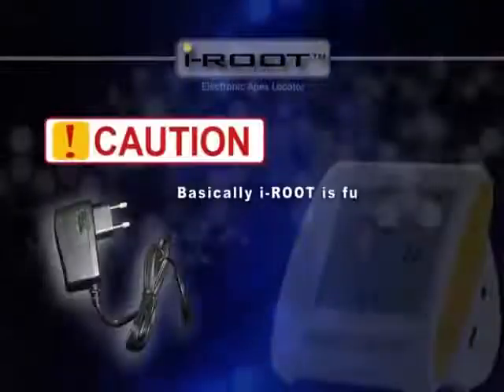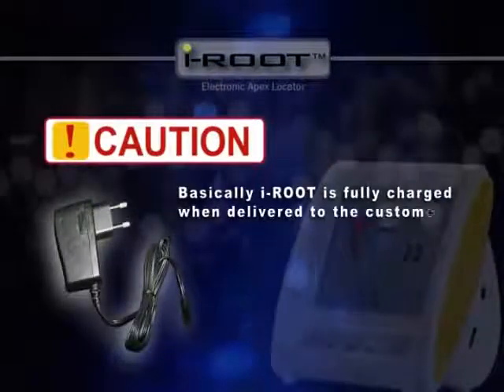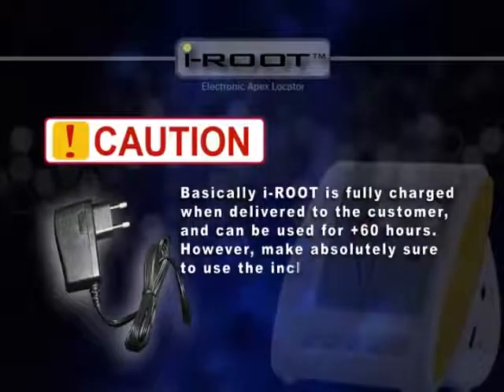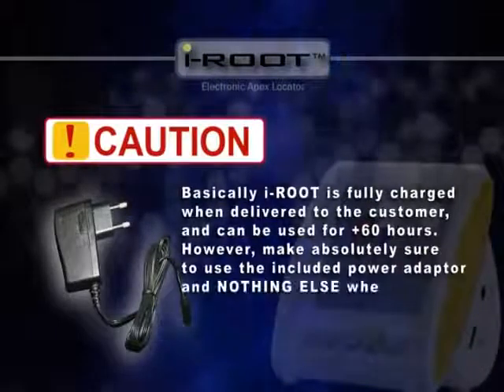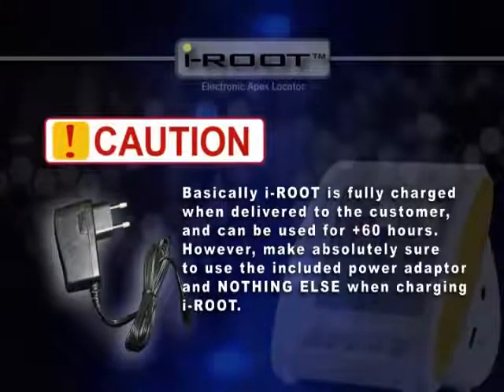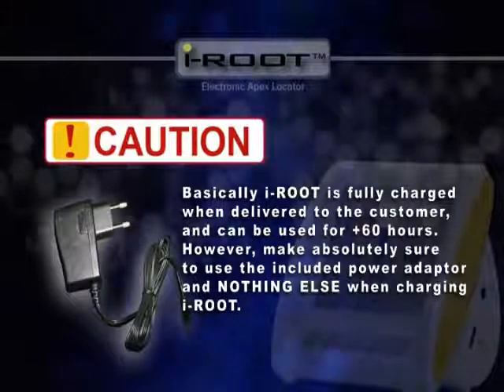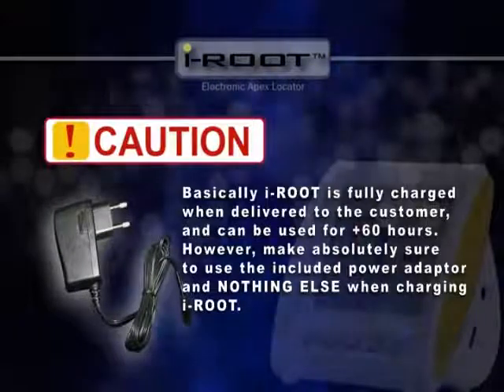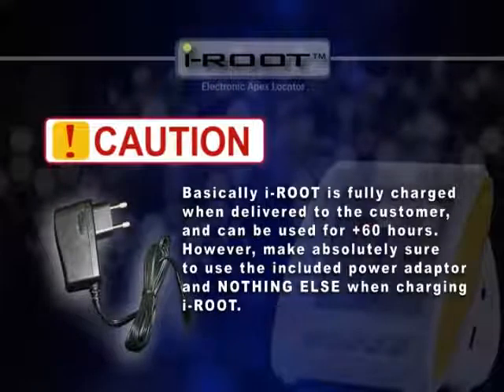Things to keep in mind when using iRoot. 1 power adapter is included in the package you receive for charging the lithium-ion battery. Basically, iRoot is fully charged when delivered to the customer and can be used for 60 plus hours. However, make absolutely sure to use the included power adapter and nothing else when charging.